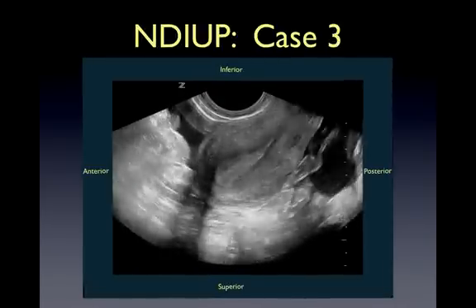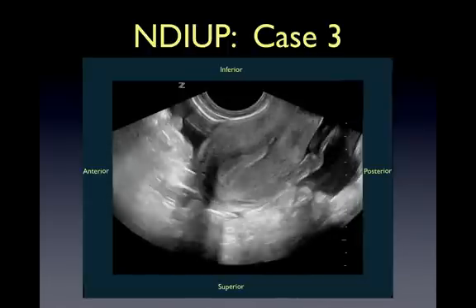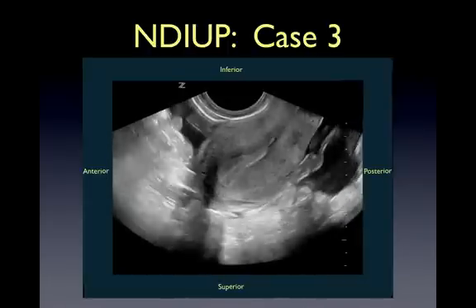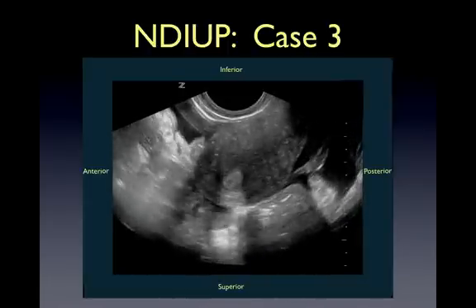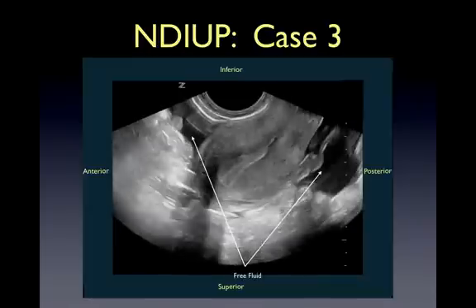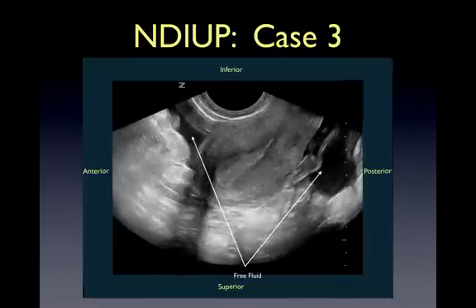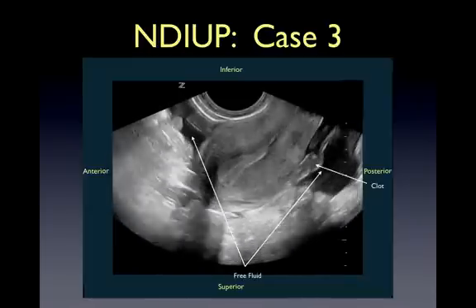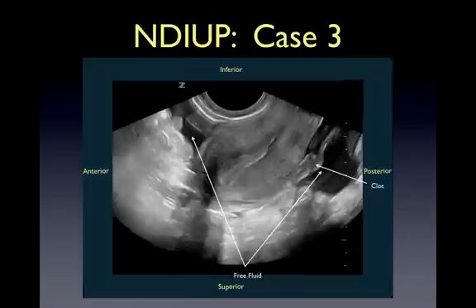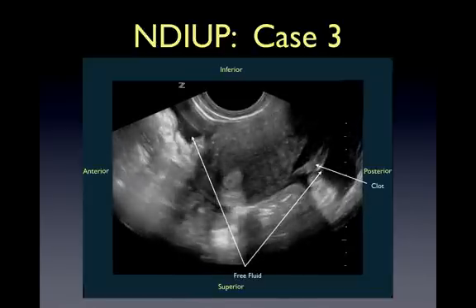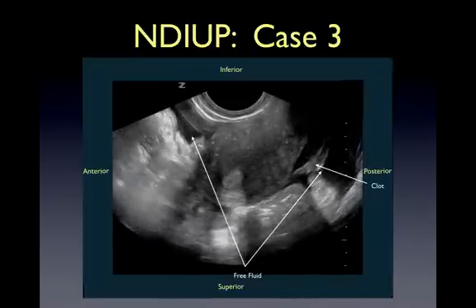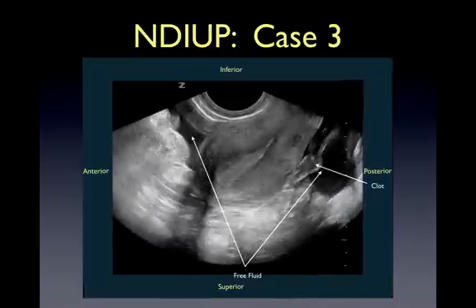This third case of an NDIUP shows an empty uterus viewed sagittally with surrounding free fluid, as well as hyperechoic material likely representing clot. In any HCG-positive female with an empty uterus and free fluid, always suspect ruptured ectopic.